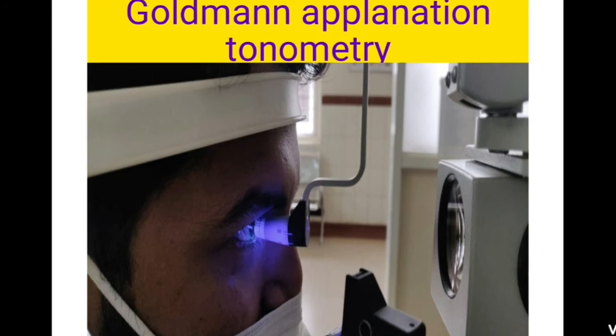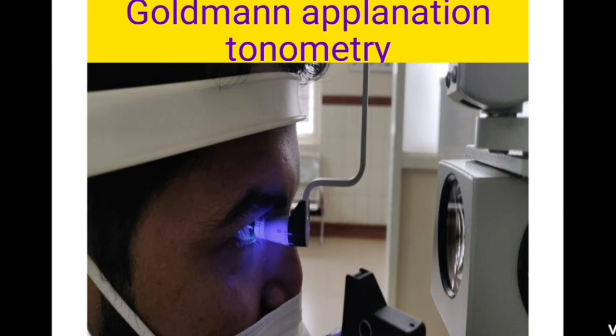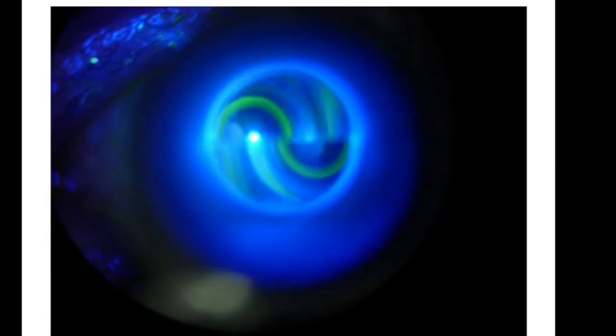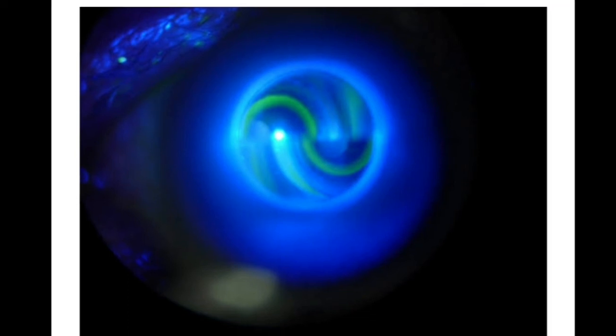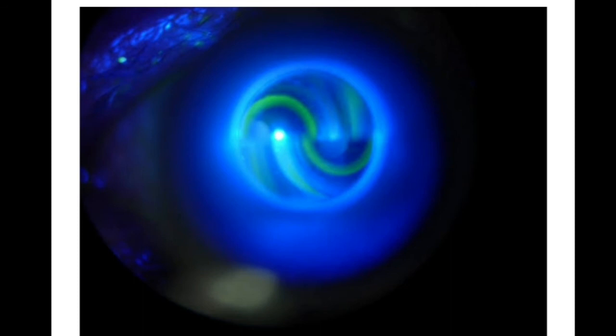Disinfection of Goldman's applanation tonometry prism: soak the tip for 5 to 15 minutes in 70% isopropyl alcohol or hydrogen peroxide. Advantages: this is the gold standard for measuring IOP, with very accurate results. Disadvantages: requires a slit lamp and the patient must sit — cannot be used in bedridden patients. Requires an anesthetic agent. There are also chances of corneal abrasion during the procedure.